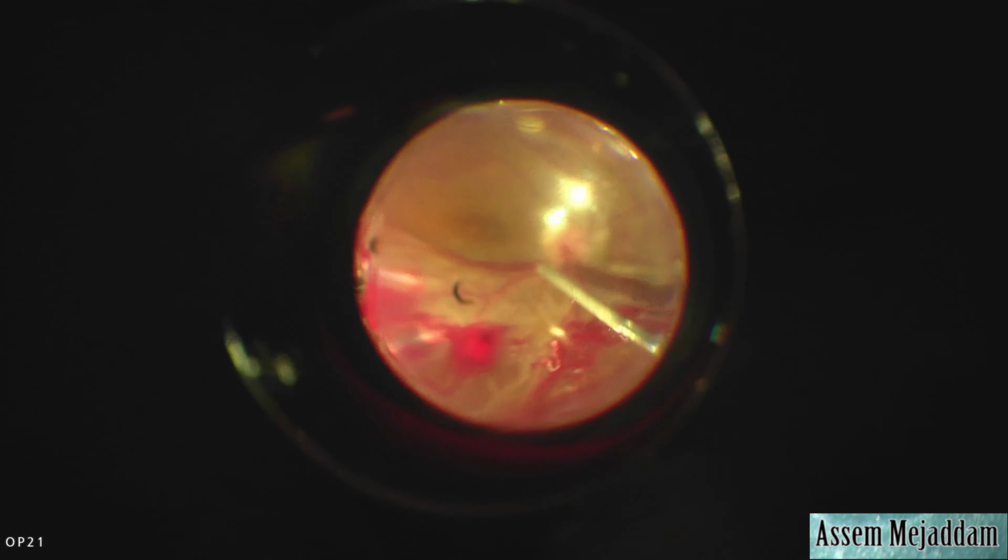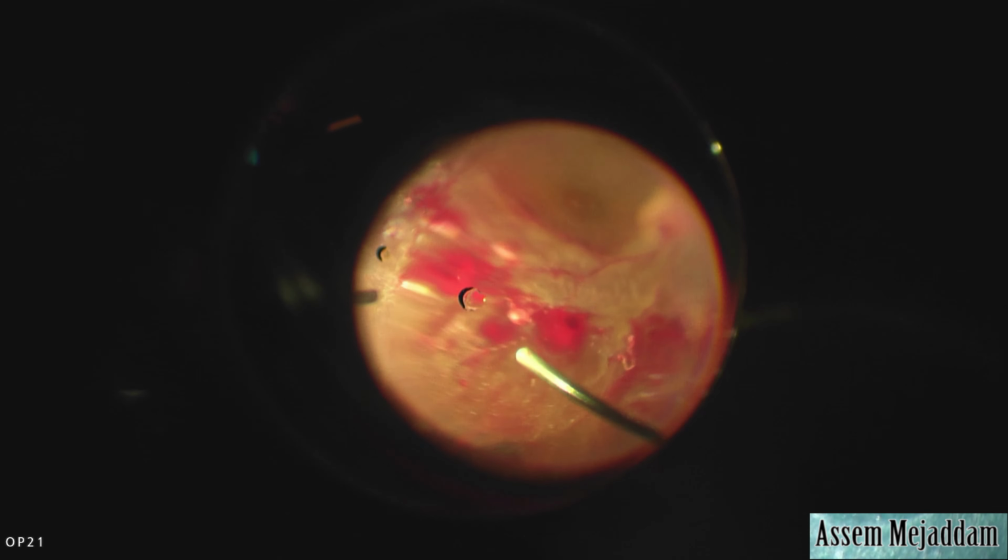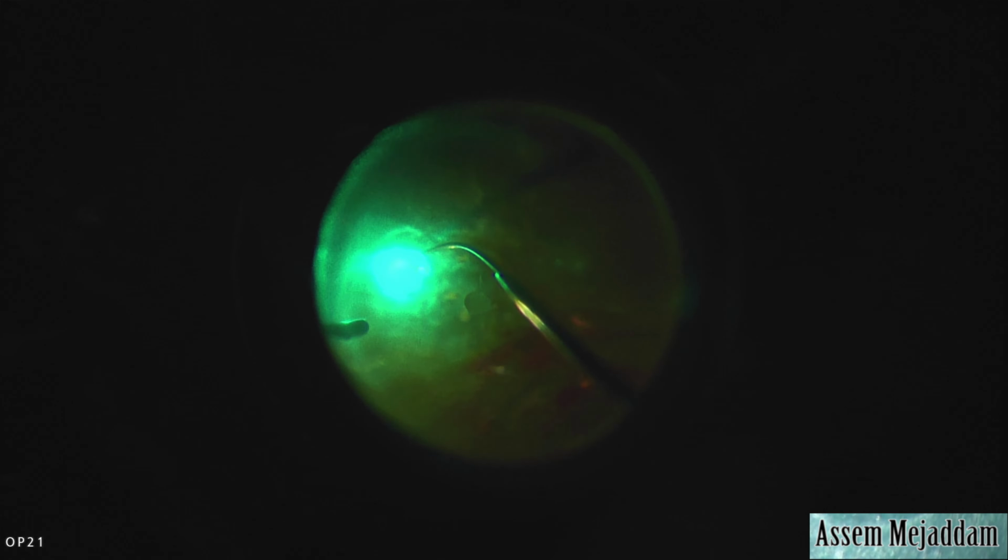And so convert to fluid air exchange and do some more laser and end the case with gas.